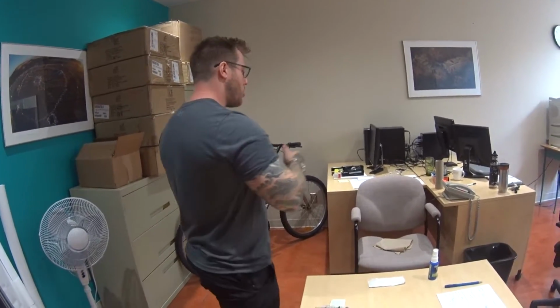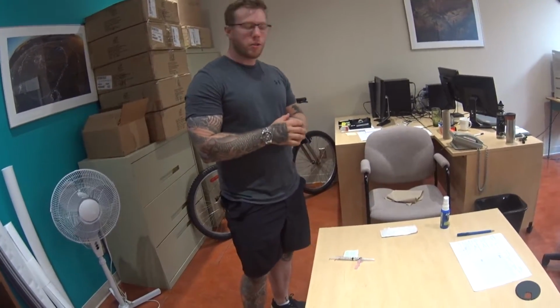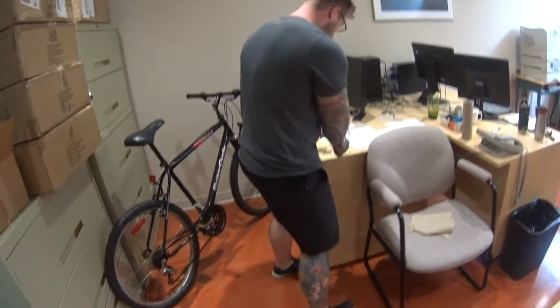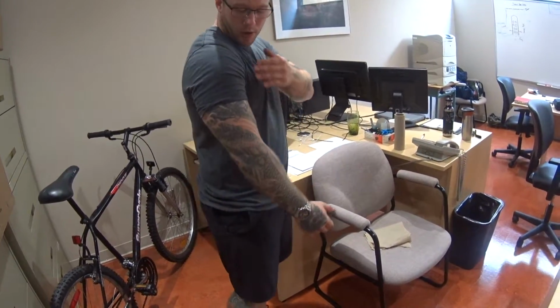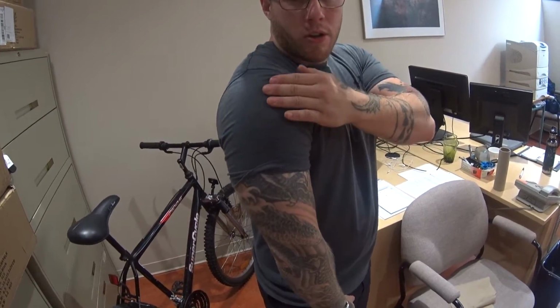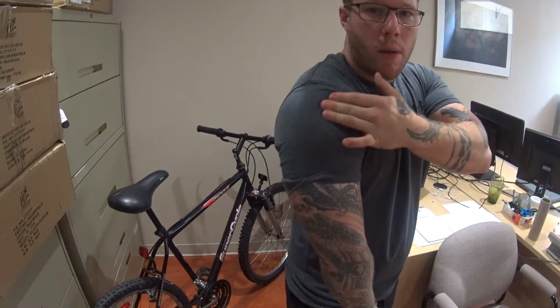I'm going to ask him which arm he prefers to use, taking into account other medical conditions, and he doesn't have any issues with any arm. So I'm going to inject him into his right deltoid. I'll approach Mr. Milton and say hi. I'm going to do it in your right arm. To landmark for this, unfortunately we don't have a mannequin, so for testing purposes I'll just show you on myself. You're going to find the acromion process on the shoulder here, and I'm going to use 3 fingers down, or 1.1 to 2 inches, and that's where we'll use our injection spot.